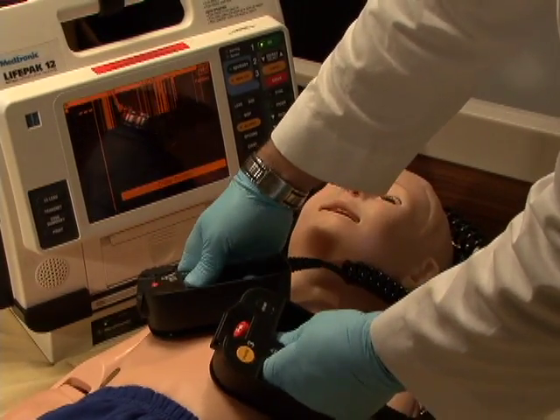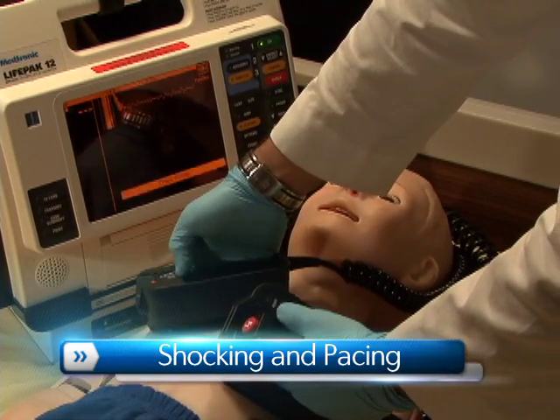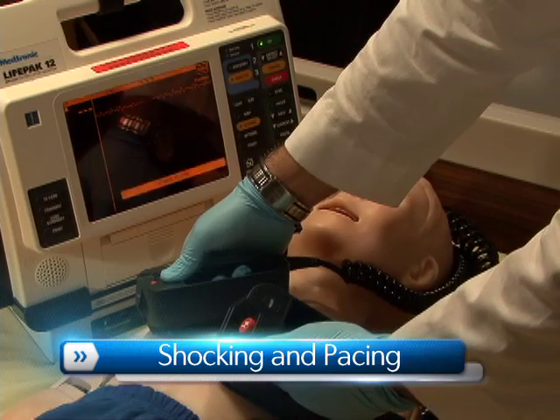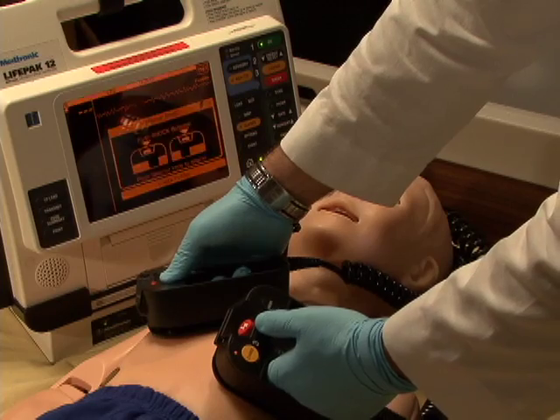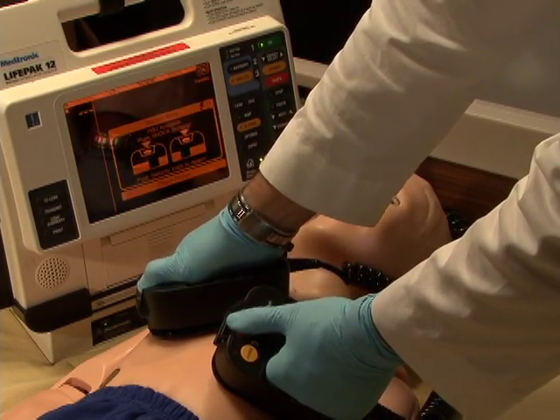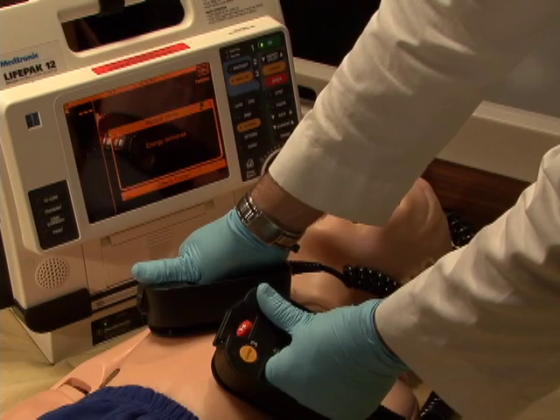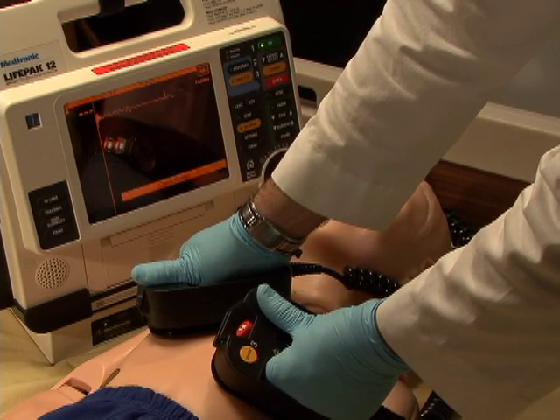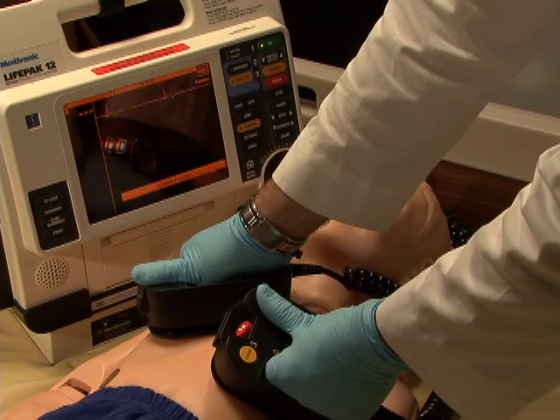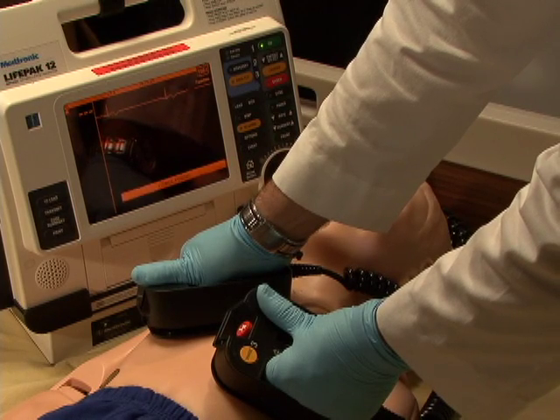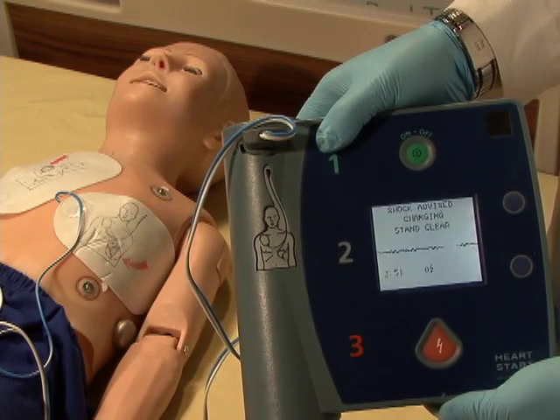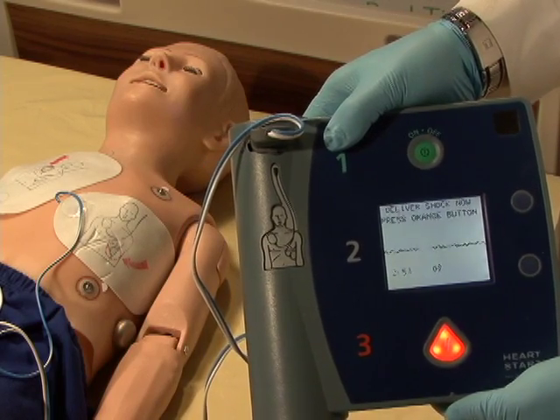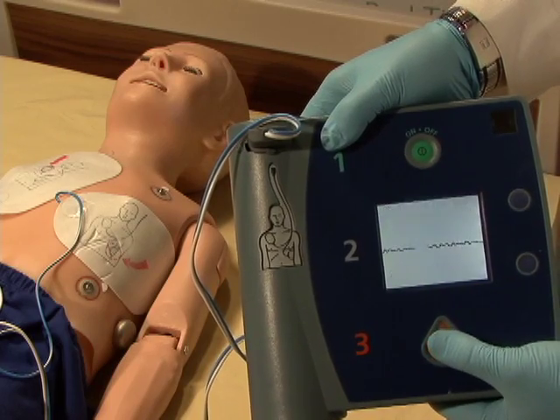To add to this realism, Pediatric HAL can be shocked or paced with real energy for cardioversion, defibrillation, and pacing drills. An AED will display Pediatric HAL's ECG, analyze his cardiac rhythm, and advise action — a perfect addition to competency-based programs.